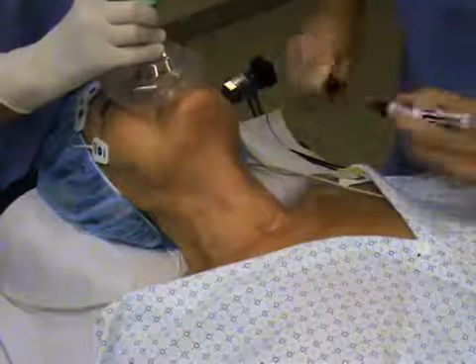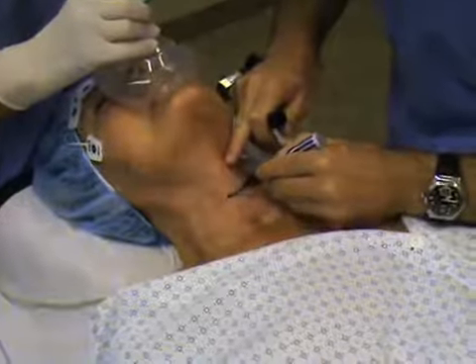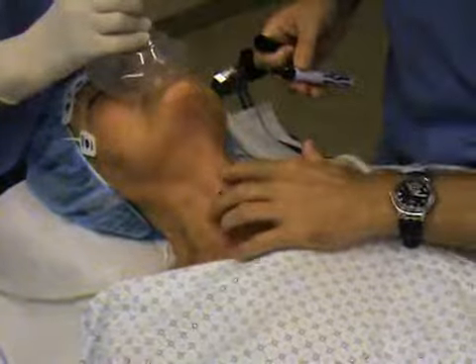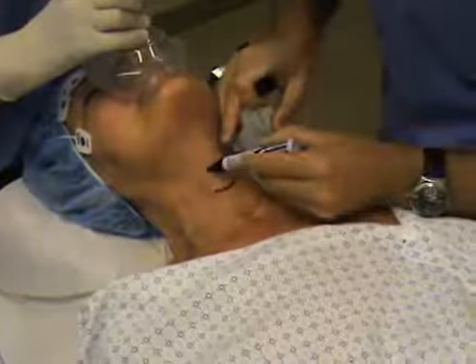Alternatively, you can introduce the anesthesia by direct injection via puncture of the cricothyroid membrane. This direct injection technique is reliable, time-efficient, and easy to perform.